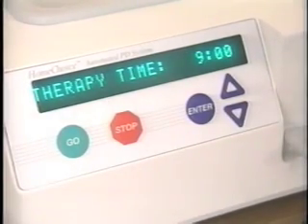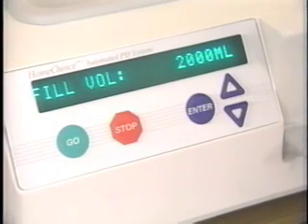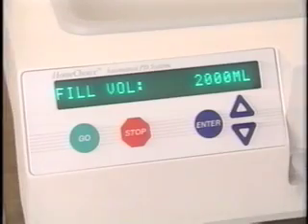The second parameter is the total therapy time. Press the down arrow again. The third is fill volume. This is the volume of solution to be used for each exchange. Press the down arrow again.